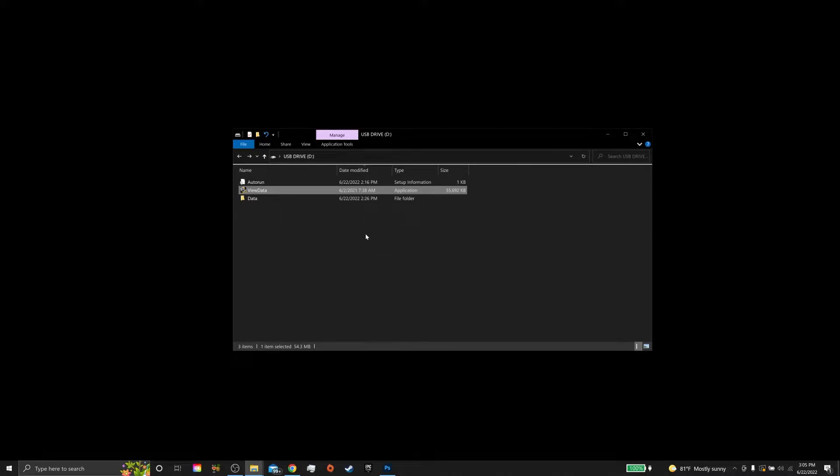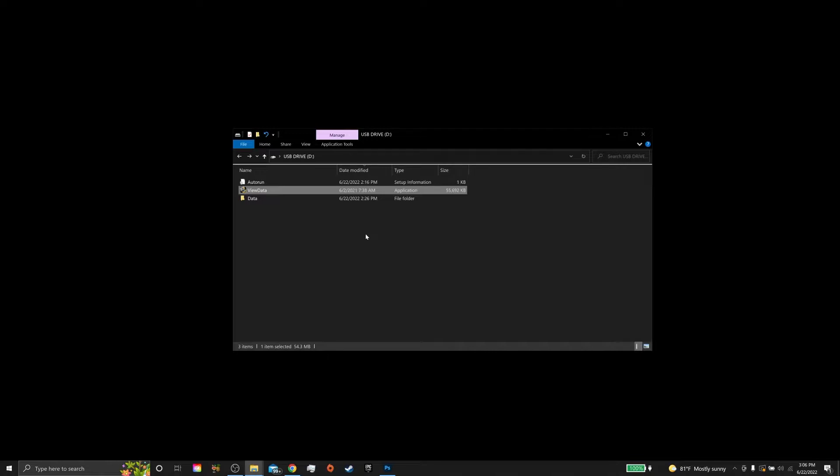This video will run you through what to do when you receive a CBCT scan from a CareStream Dental CBCT on a USB drive from another doctor, office, or clinic.